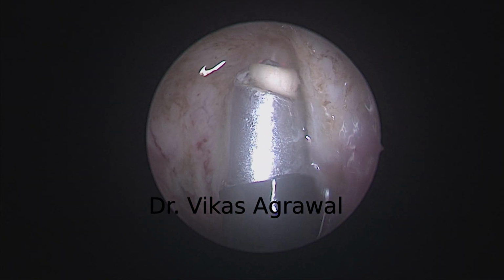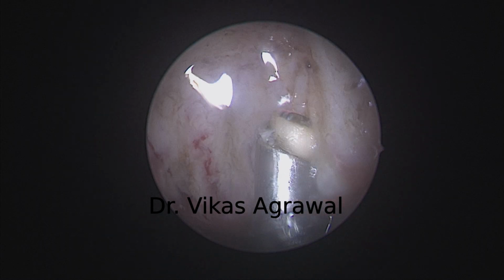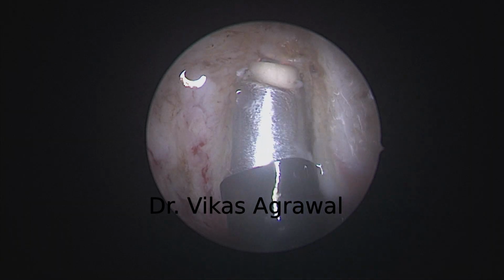And here we are reaching the fossa of Rosenmuller, which is the lateral boundary posteriorly.